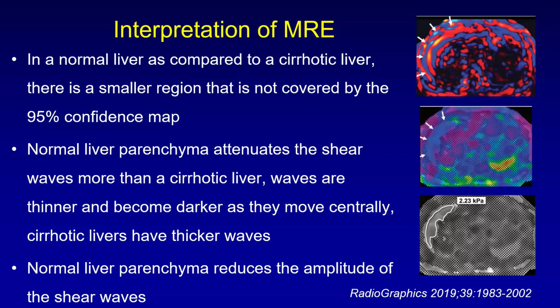For a normal liver, if you get this kind of acquisition, it is okay to accept it and go ahead with the measurements with whatever little liver you have, because it is the inherent liver parenchyma property of a normal liver that is not allowing you to draw a bigger ROI in the entire liver volume.